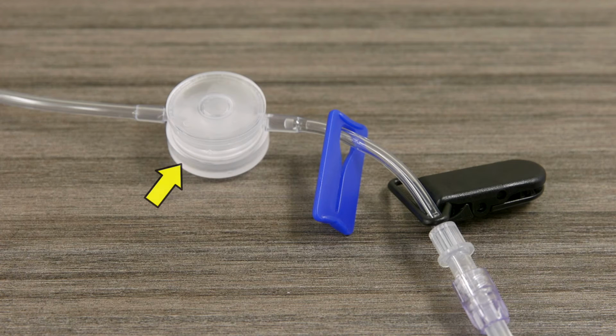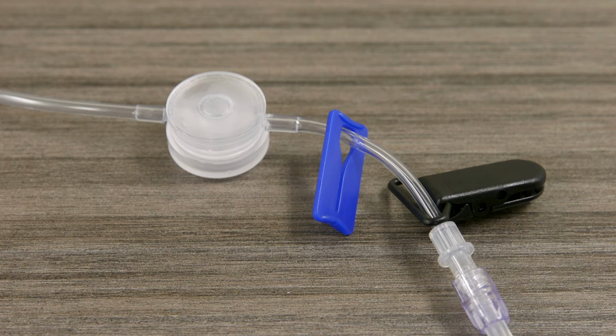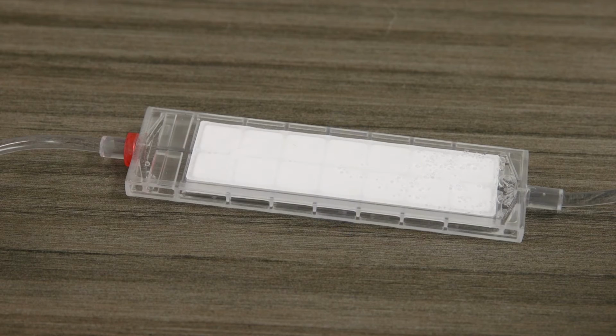A pressure regulating valve prevents abnormally high pressure greater than 300 millimeters of mercury from reaching the set or the patient. If pressure exceeds 300 millimeters of mercury, the flow of fluid will stop. Flow will continue when pressure is reduced to a safe level. A second valve built into the set prevents air entrainment by stopping flow if a partial vacuum is present.